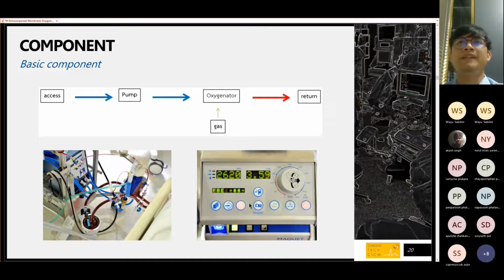So they seem to move in the same direction and relate to each other, but with a centrifugal pump there are other factors that disturb the output, like LPM.